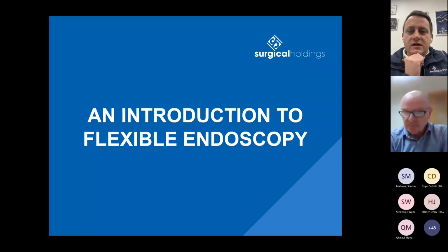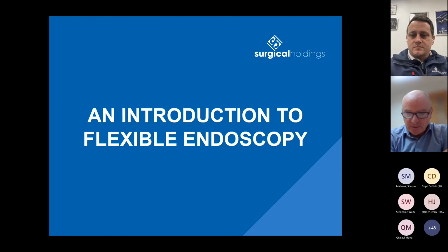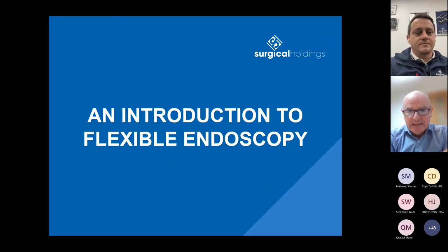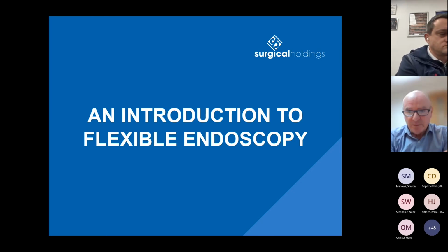Yeah, understood. Another question on here, just around the lifespans of flexible scopes. How long would you expect them to last? How often should they be serviced? That's an interesting question, because it differs from country to country. In the UK, we actually did a study many years ago, and instruments last a lot longer, and they use a lot more patients in this country than in the rest of Europe. It basically depends on whether you have the scope on a service contract or not, because if you do, it should be getting serviced and repaired regularly.